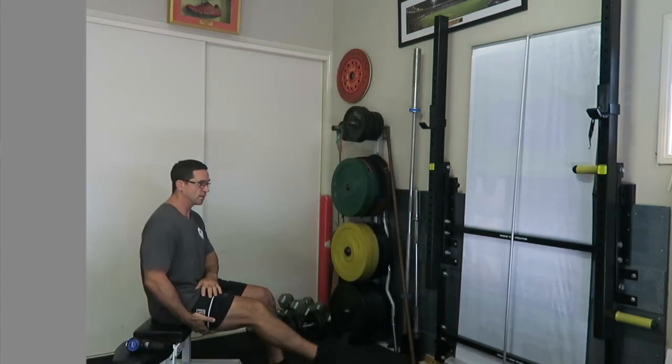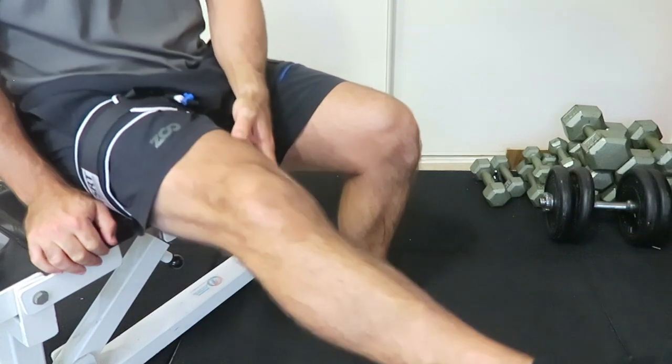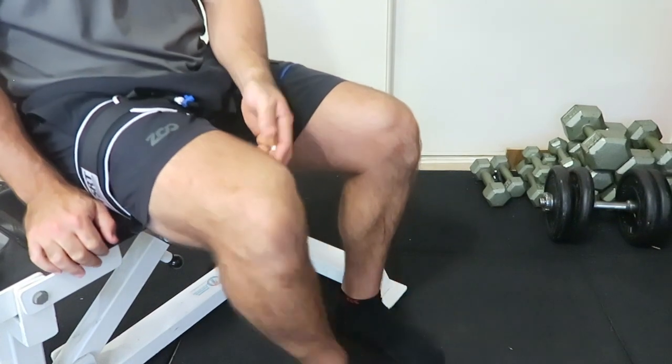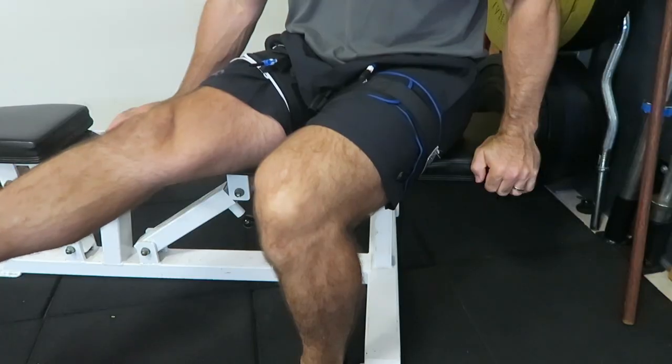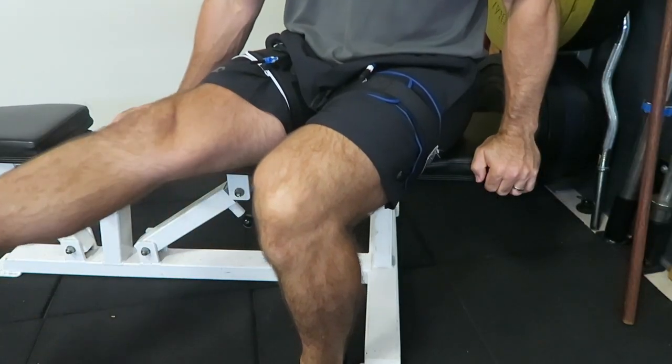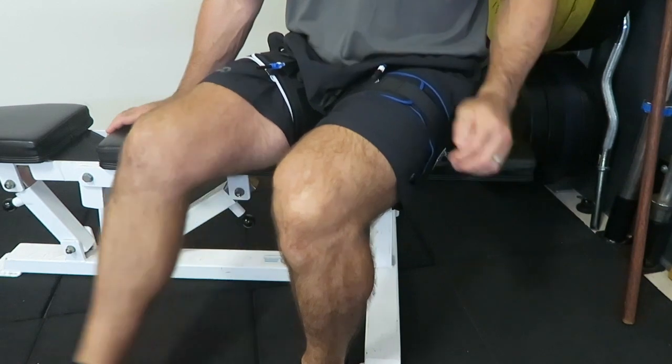So the first one in sitting is just a leg extension. From this point here, we're just going to extend the knee out. Just a normal, typical leg extension, and this could be done on a kitchen chair. Three sets of 15 is a typical rep and set range here, which would work quite well.